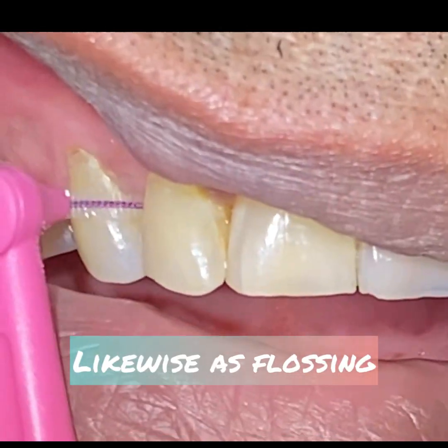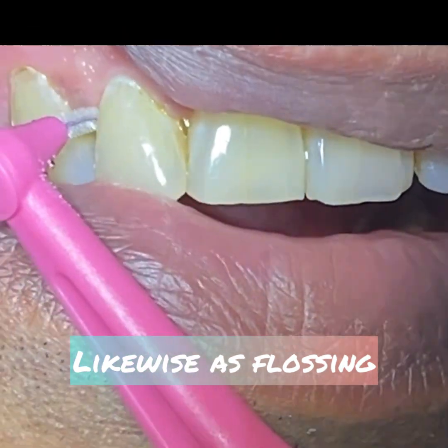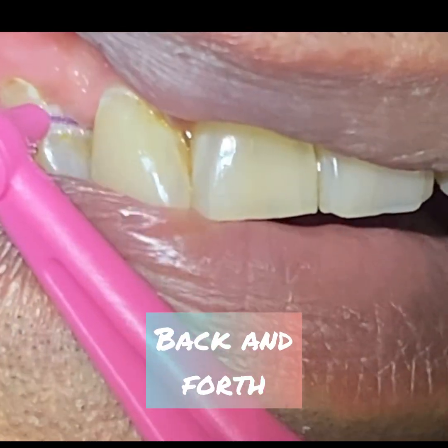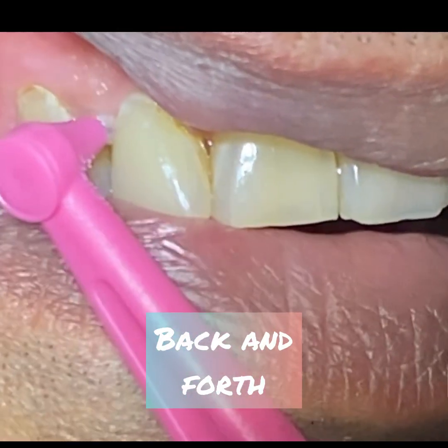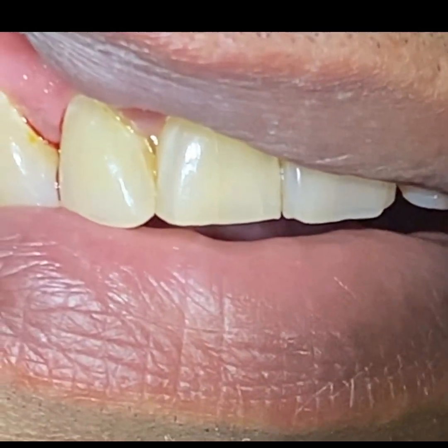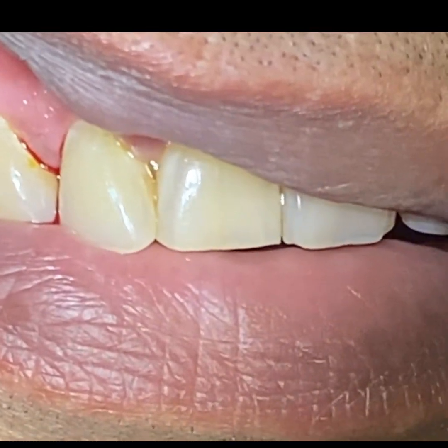Doing it here, it goes into this space, this sulcus. Look, like this. Can you see? Going below the gum. Bring it out and do the other side. Now this tooth is clean. If you have bleeding like this, do it religiously twice a day, and the bleeding will automatically stop.